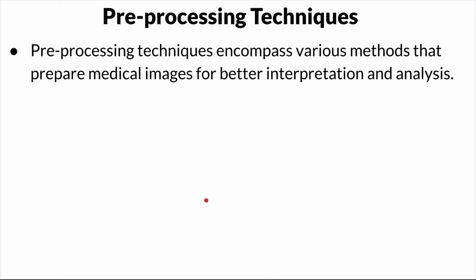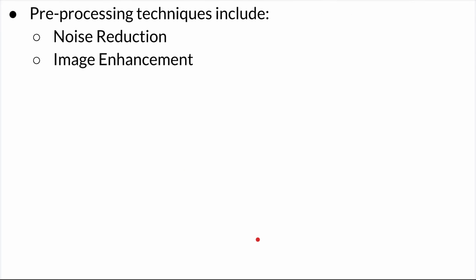All right, so pre-processing techniques. We have to do this before we even start the processing. Pre-processing techniques deal with the various methods that prepare the medical image for better interpretation and analysis. So what are some of these techniques? Let's see. We have noise reduction and image enhancement.